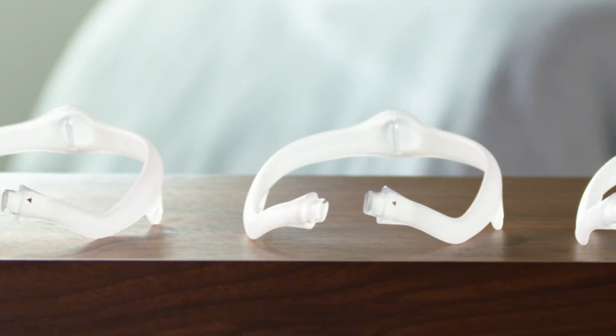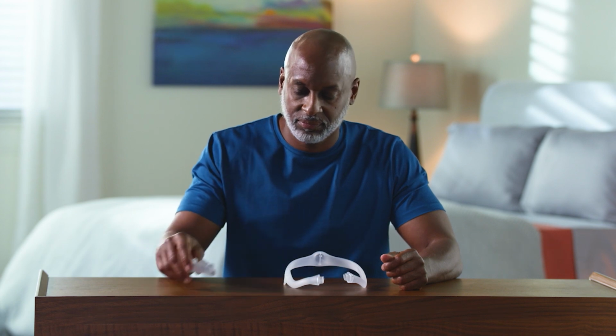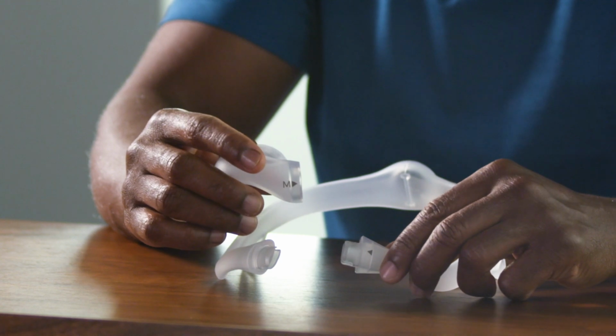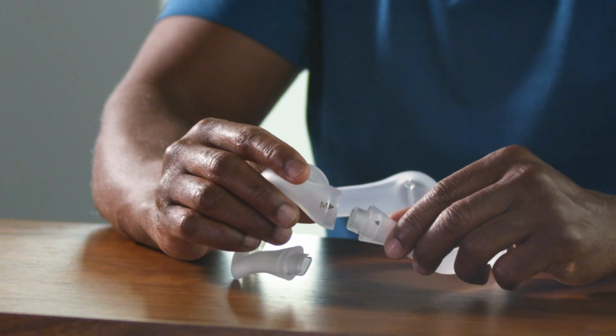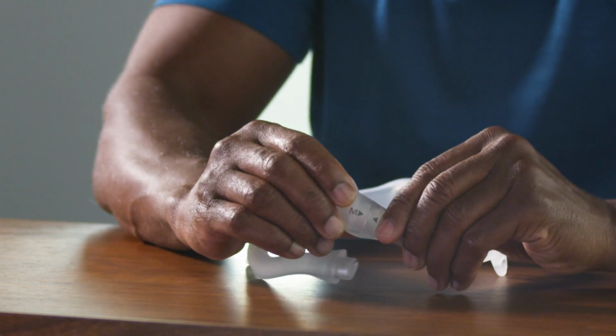DreamWear frames are available in small, medium, and large. If your mask is not already assembled, begin by attaching your cushion to a medium frame. Align the triangles on the sides of the cushion to the ones on the mask frame and press until you hear them snap into place.